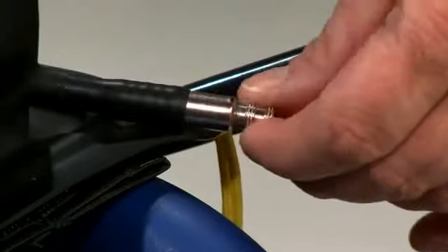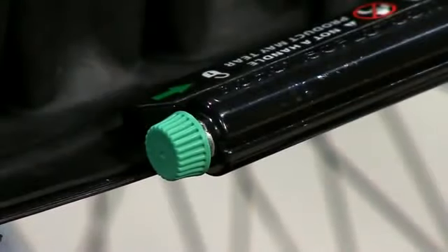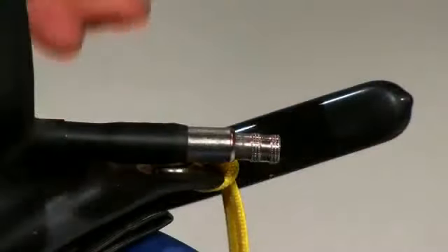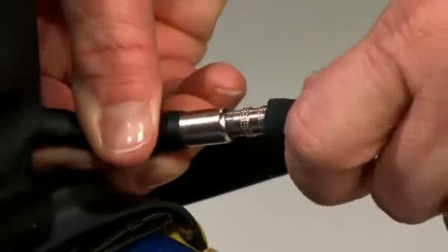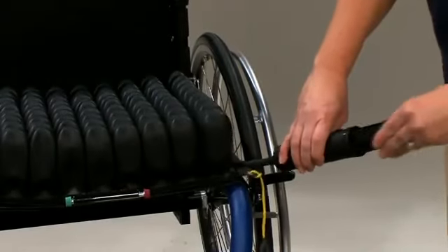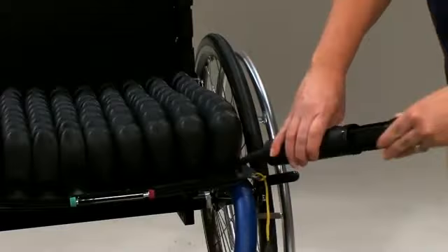Next, turn the air valve counterclockwise to open. Make sure the isoflow memory control is also open by pushing the isoflow's green knob to the right, or unlocked. Slide the pump's rubber nozzle over the air valve and inflate the cushion until it begins to slightly arch upward. Air will travel to the closest quadrant first, then pass through the isoflow valve to inflate the other quadrants. This is why the first quadrant looks overinflated when you start the inflation process.